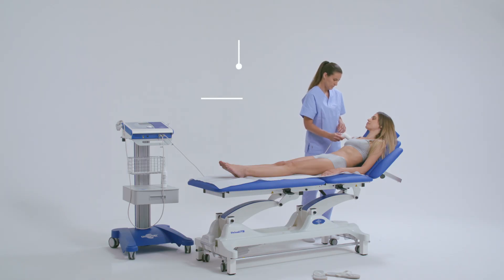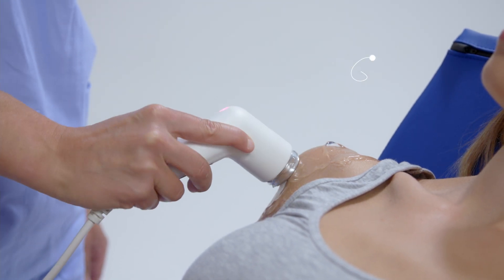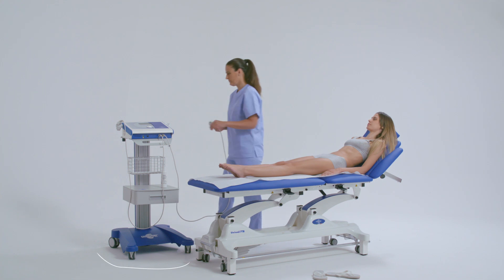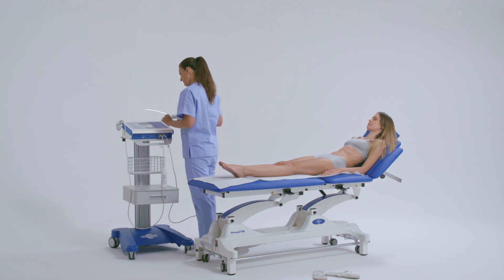In order to perform the treatment in the most effective way, it is essential to keep the handpiece at a 90-degree angle to the skin by making circular movements, insisting on the areas of fibrotic adhesion that limit the range of movement.